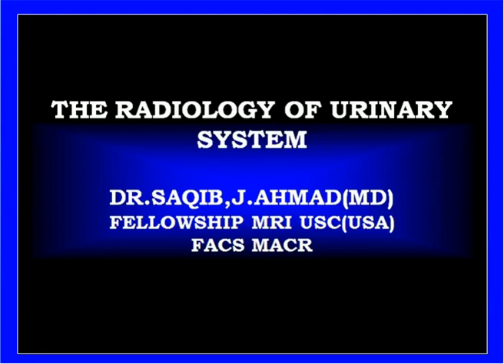My today's presentation or lecture is regarding the radiology of the urinary system. Since there are so many diseases and conditions which involve or can involve the urinary system, this discussion will be divided into 3 different lectures. Now we are today discussing the first part of this discussion.